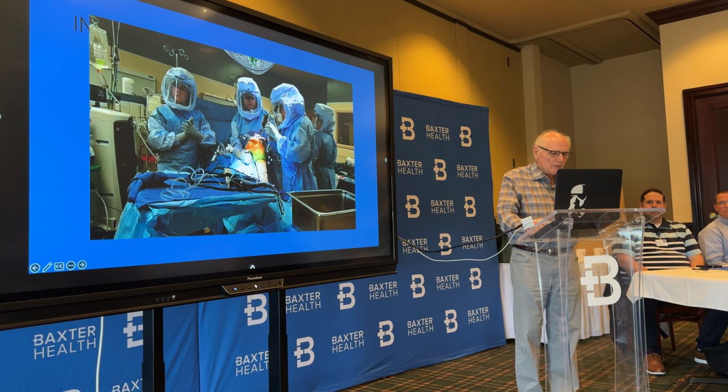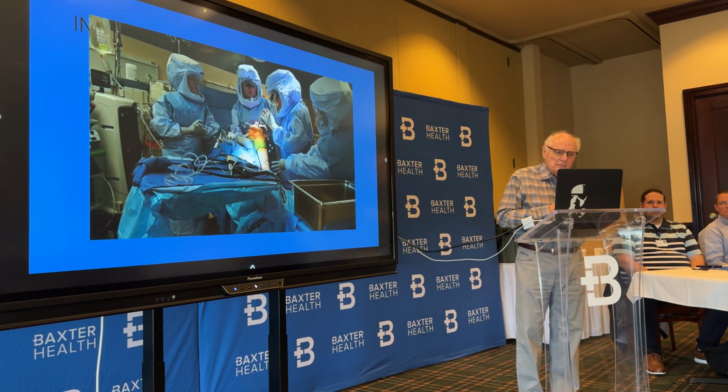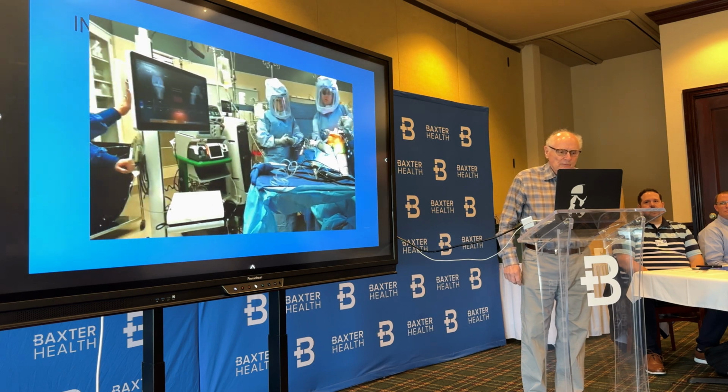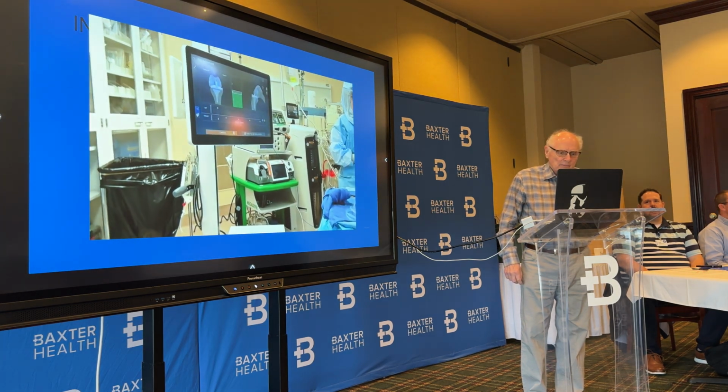So, this is a short video of a case I did recently. I'm using the soft tissue tensioner as the final point of my preparation for this case. We put this in, and we're looking simultaneously at the screen. Once you get it in, there you go, that green section, that's the perfect amount of pressure there.